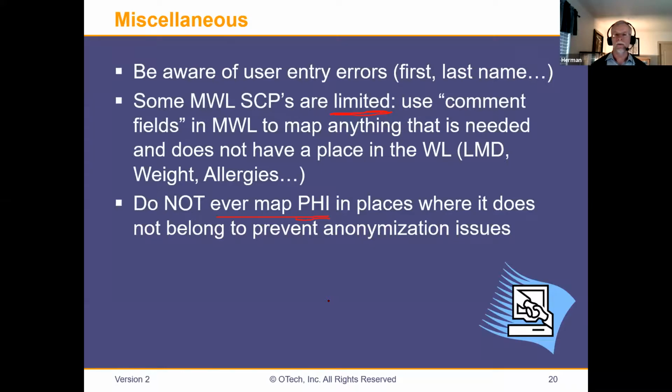Before we do that, no problem, we anonymize all of the information. We take out the patient name, but in a comment field, the patient name is still there. I saw that a few weeks ago or so in a series description. They put in this hospital, they put the name, CT head without contrast. No. Make sure that you don't do that, because down the line, and the case I'm talking about was for a clinical trial, somebody has to try to clean it up.